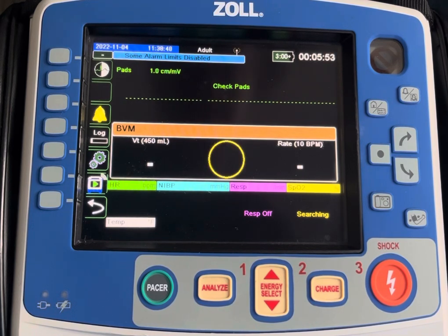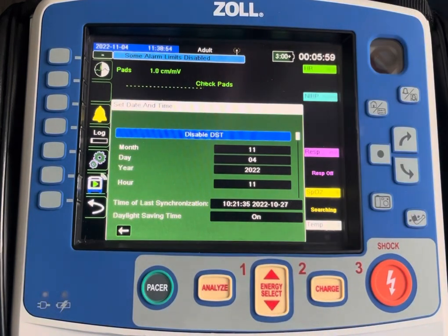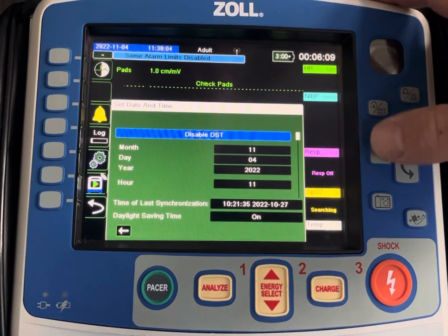It's very simple on the X-Series or X-Series Advanced. You highlight the clock section in the upper left corner and press Enter. It should currently read Disable DST, and that's what you want to do come Sunday. We're going to disable DST for the fall and winter months.